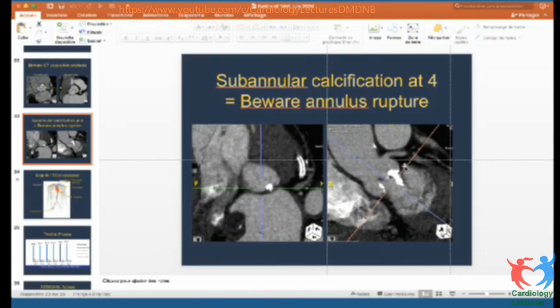Jose, you wanted to tell something? Yeah, so Dr. Syed, that was a great presentation on the basics of TAVI. I just want to ask you a couple of questions. Many of the audience here would be beginners for TAVI. So other than bicuspid and presence of calcification, are there any groups where you would have preference for a balloon expandable or a self-expanding valve? Most of the centers here are low volume TAVI centers. So when you're starting with TAVI, would you advise choosing a particular valve, say starting with a self-expanding valve, or do you recommend a mix of both valves based on the anatomy?